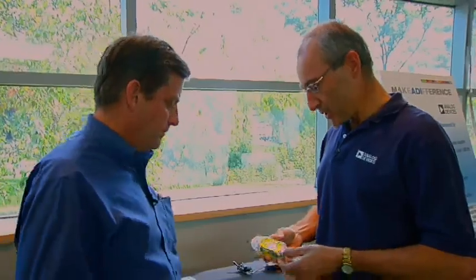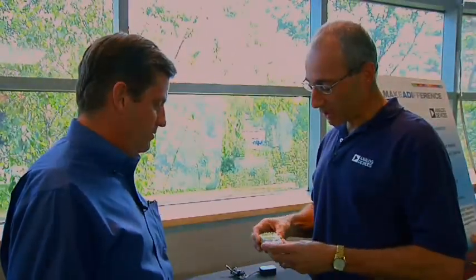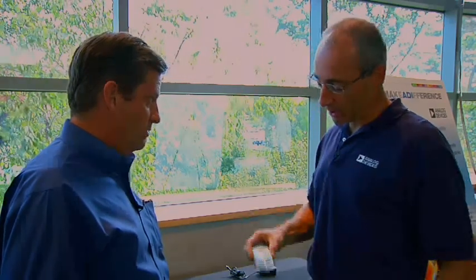Stay calm. Check responsiveness. So it steps you through that process. I'm panicking already. Call for help. That's the next step. Help. You do. Start CPR.